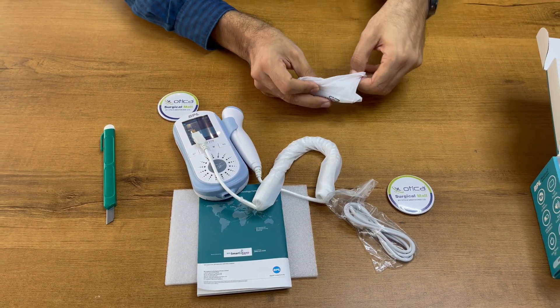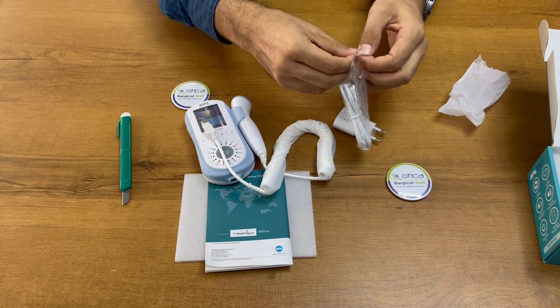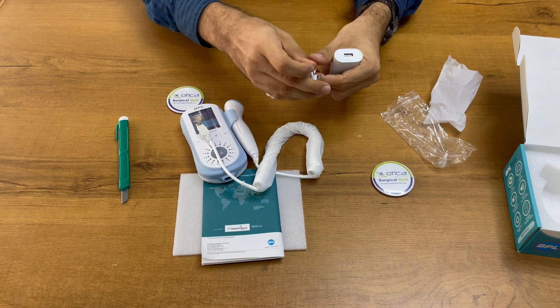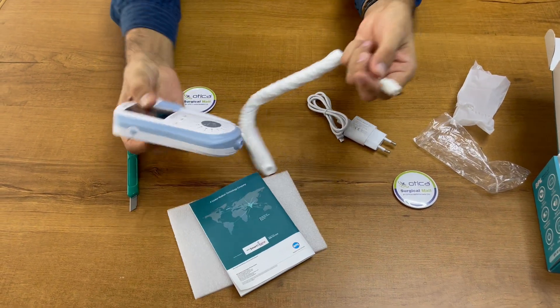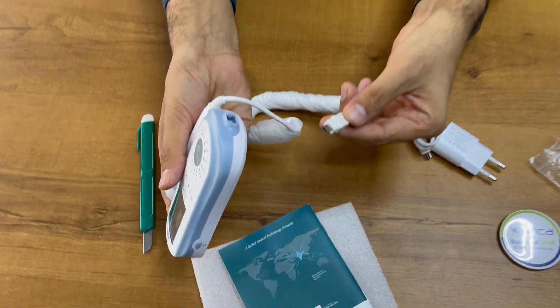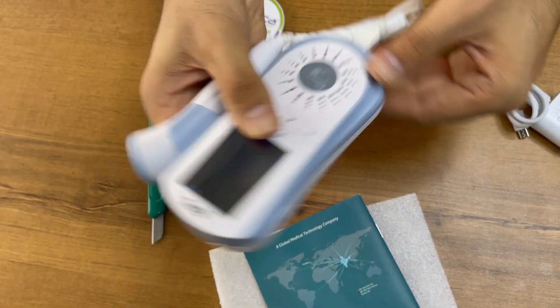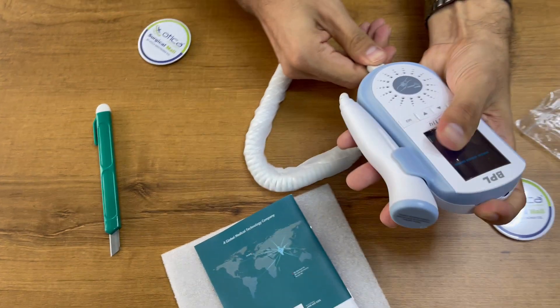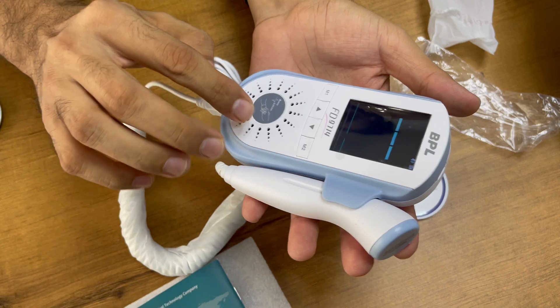You have to open it and connect it to this cable. You can put it on the charger. This is the main unit — you need to insert this cable inside. Make sure you are inserting it in a proper manner so that it fits firmly. Connect it properly. Now the device is switched on.